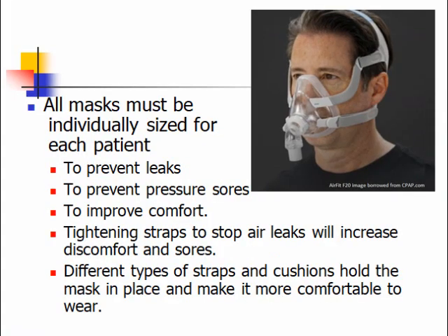As I indicated previously, all these masks must be individually sized for each person. They have large masks, medium masks, small masks, narrow masks. They all have different shapes so that they fit your face the best, because we want to prevent leaks. And if you have an abnormal shape to your face, you would end up having leaks.